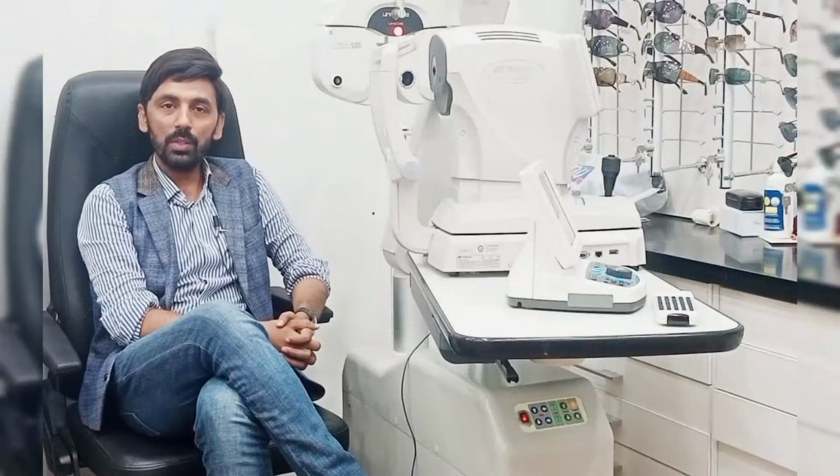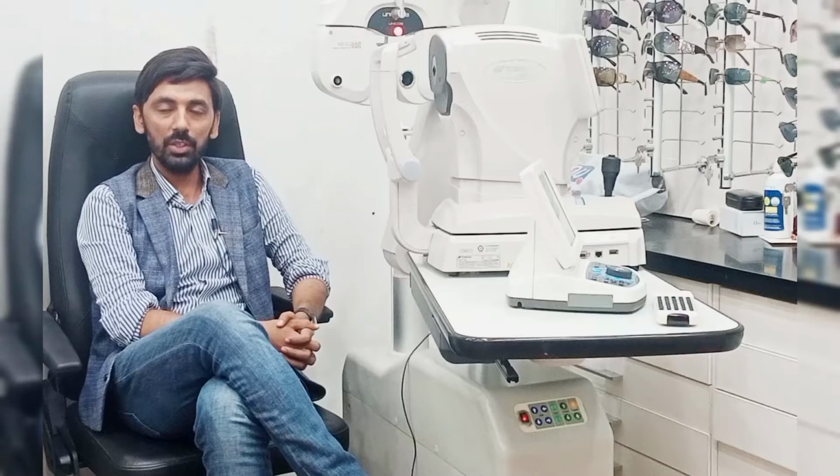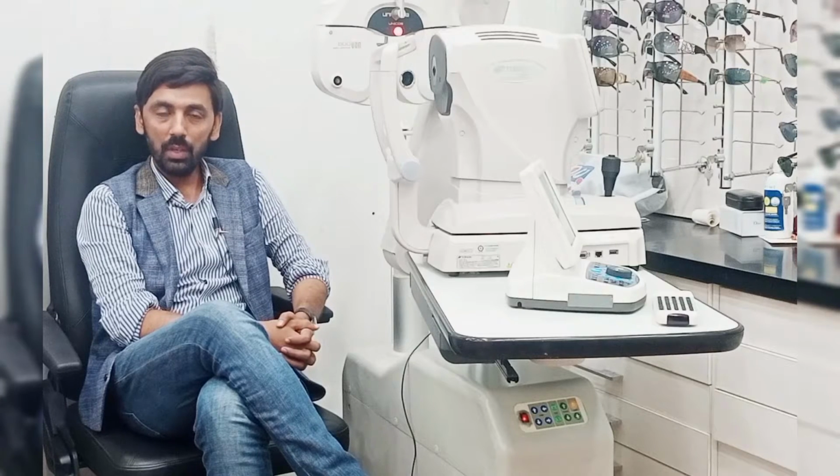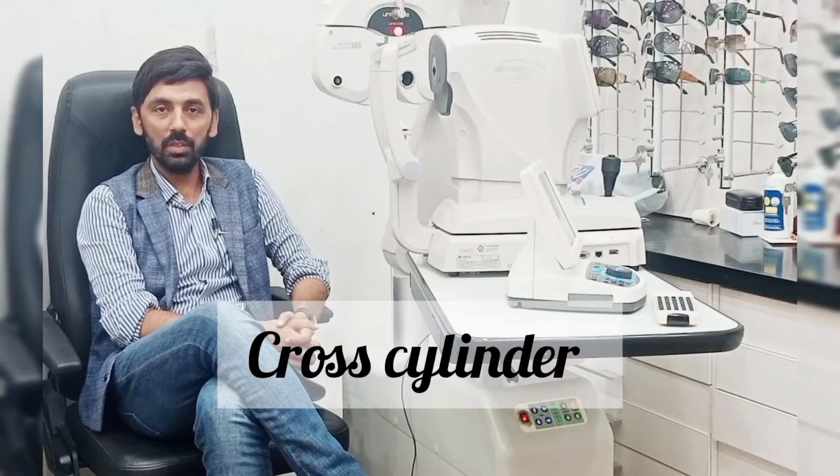So our last video was about the basic concepts regarding subjective refraction with the help of the digital phoropter or digital refractor. In this current video, we will learn how we can perform the beautiful phenomenon of cross cylinder with the help of the digital phoropter.